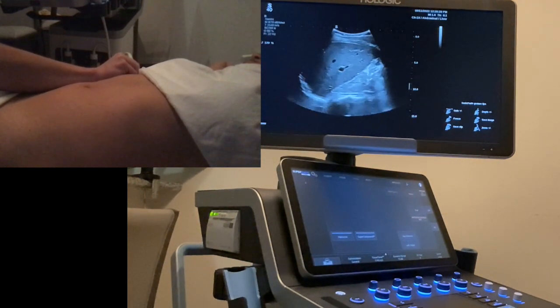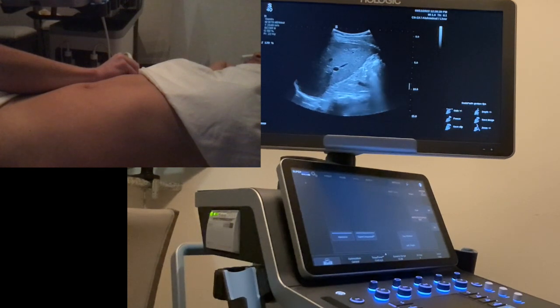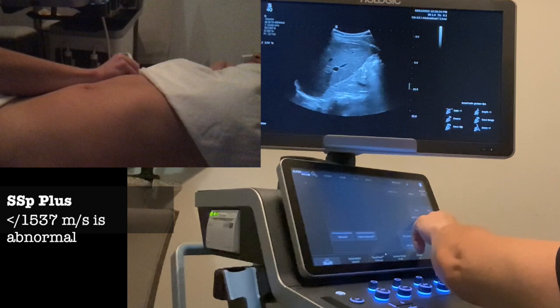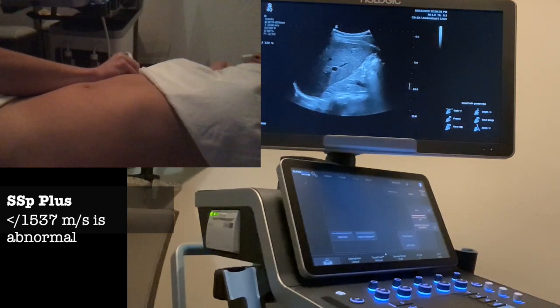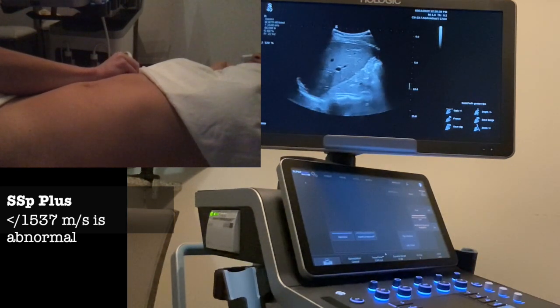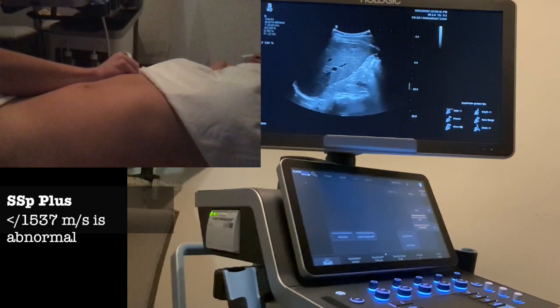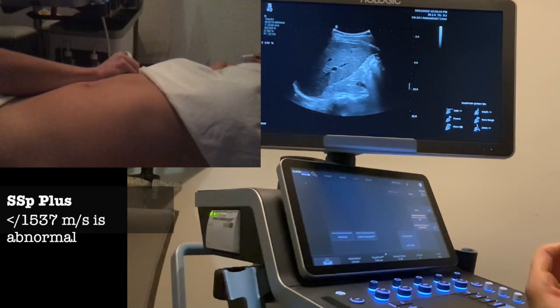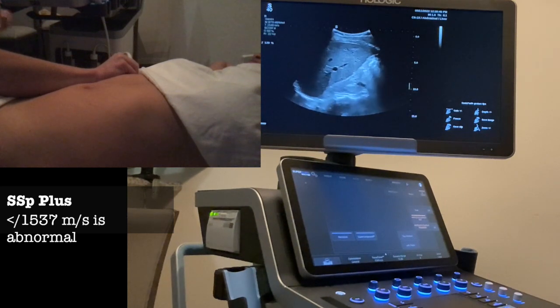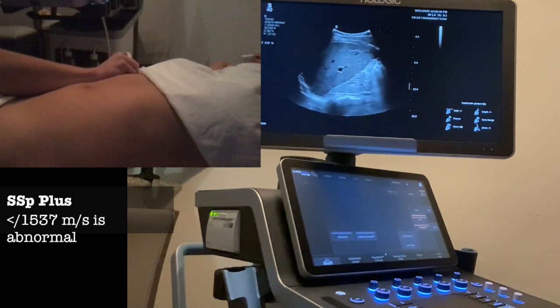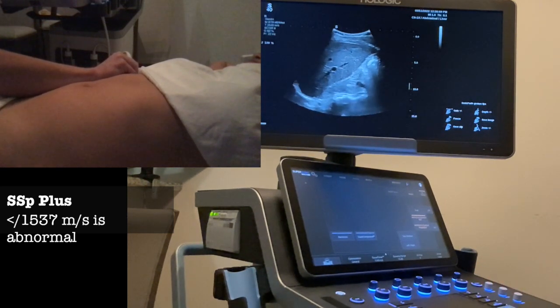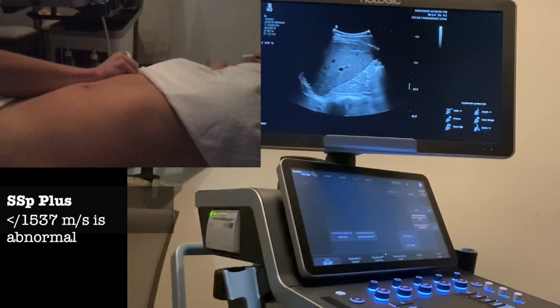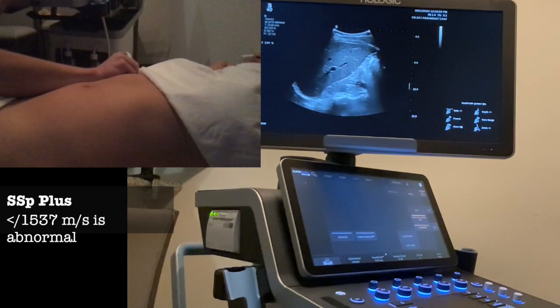First, I want to acquire the speed of sound. With the speed of sound, the higher the speed of sound, the more healthy the liver. If there's any sort of fatty liver or steatosis, the sound waves will travel slower through that.